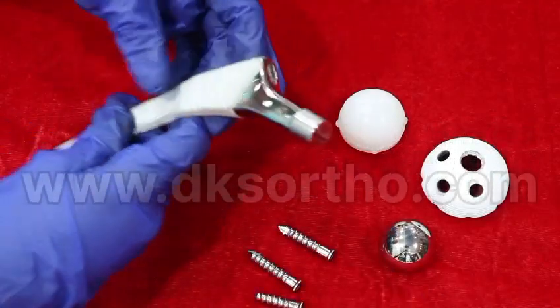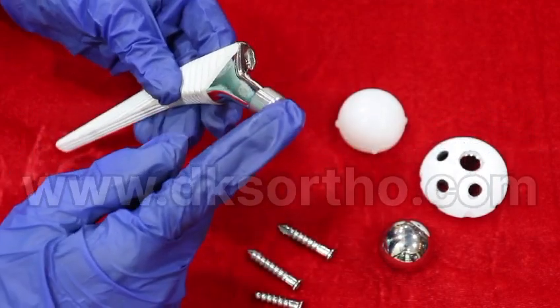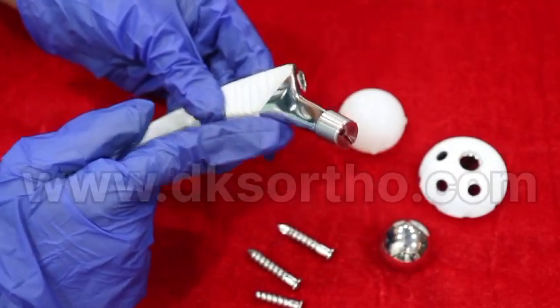This is the femoral uncemented stem. It has a 12/14 taper which is used for restoring hip biomechanics. It is available in a collarless design.